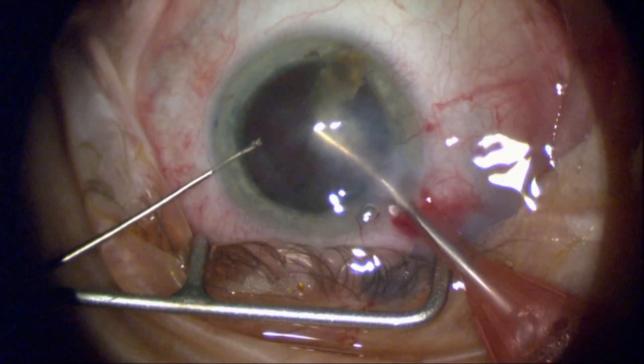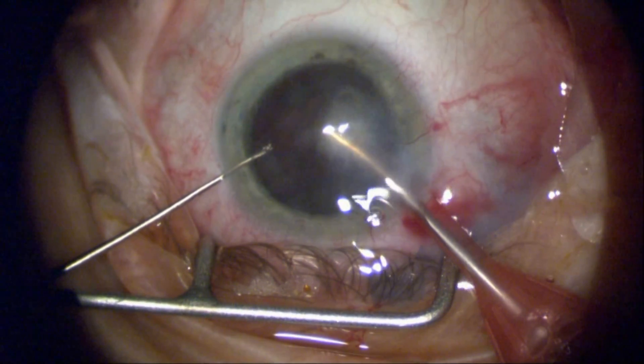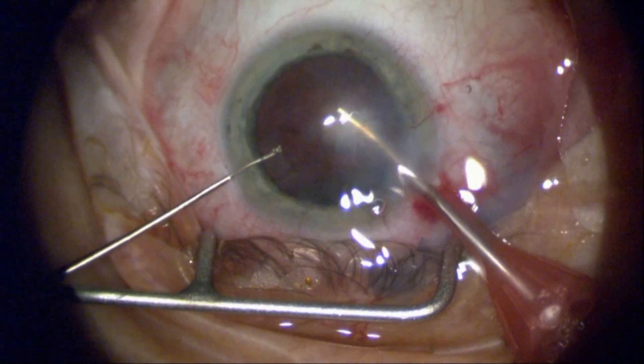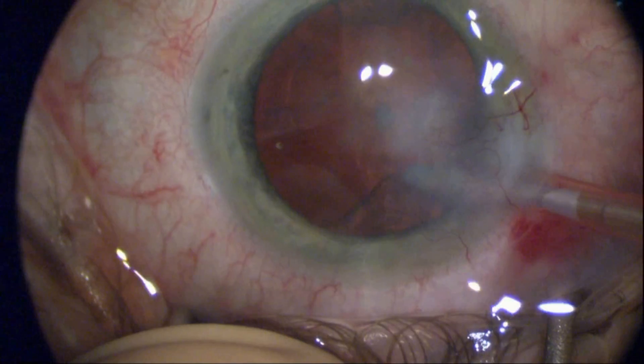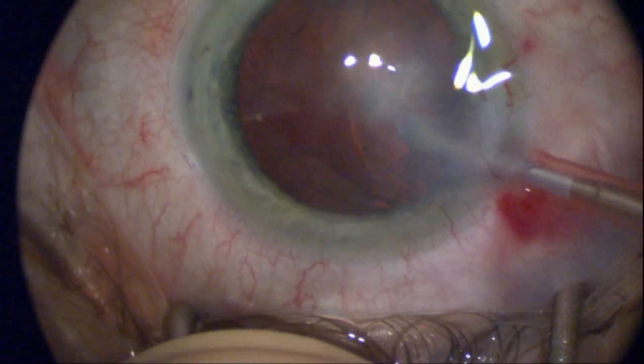Since I know that I'm going to replace the cornea, I'm less worried about the corneal endothelium. So here I'm removing this with ultrasound — something I would not be able to do with a femtosecond laser given the density of the corneal scar.